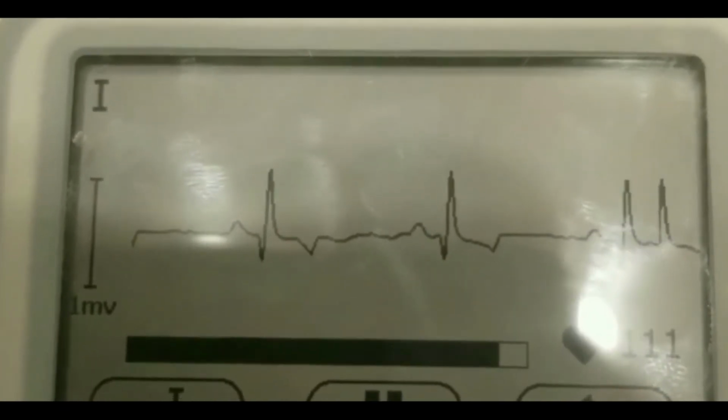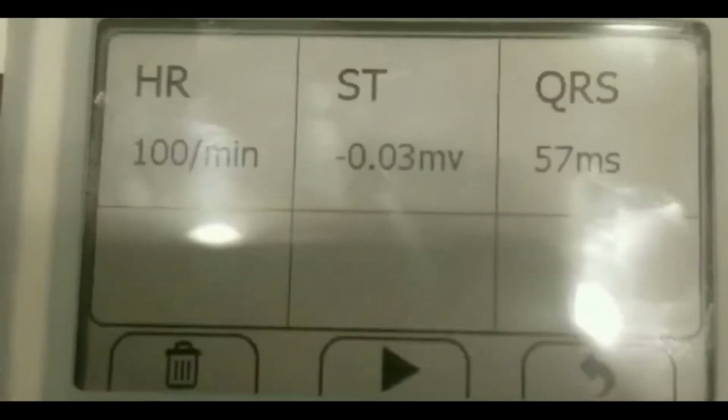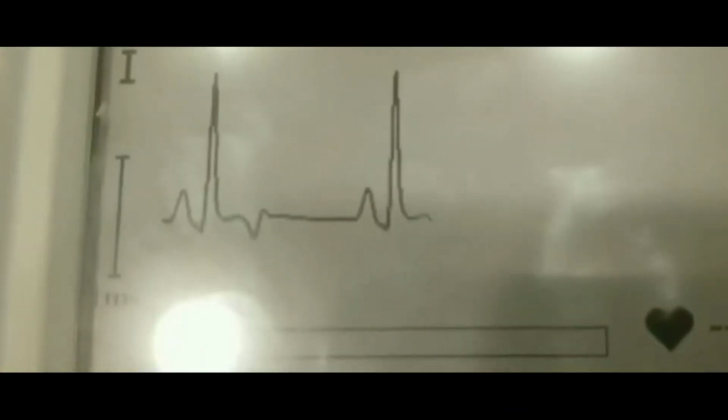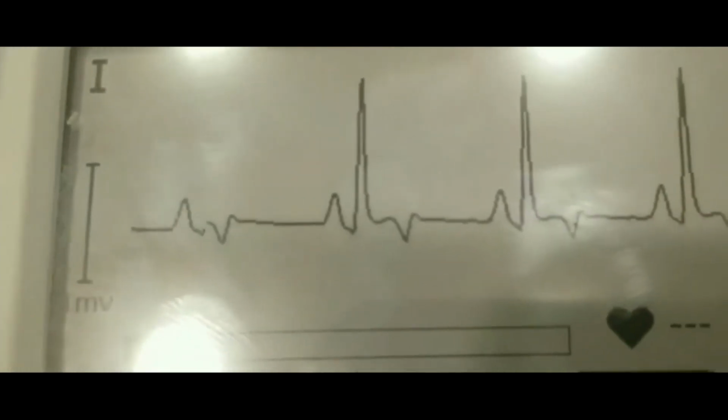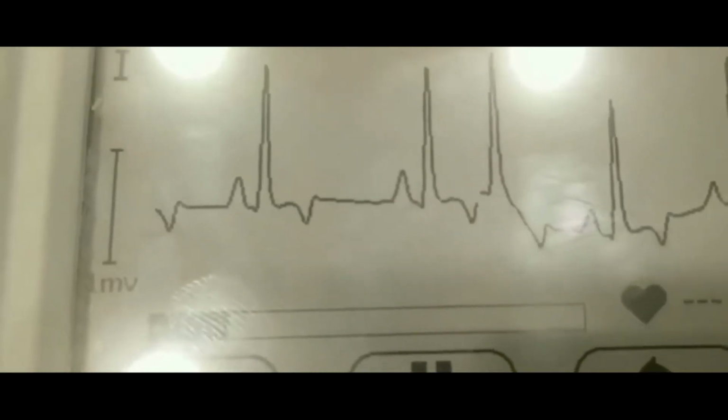wave. The T wave indicates the repolarization of the ventricles. It is a slightly asymmetrical waveform that follows after a pause the QRS complex. Take note of T waves that have a downward or negative deflection, or of T waves with a tall pointed peak. Let's demonstrate this one more time.